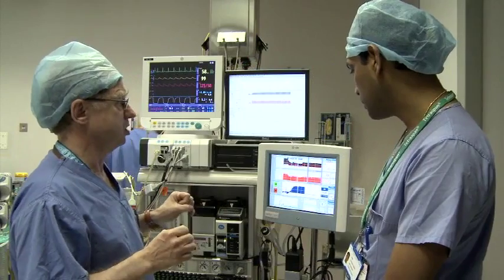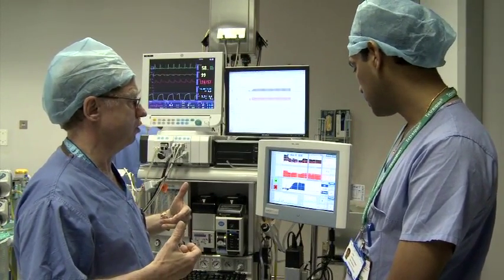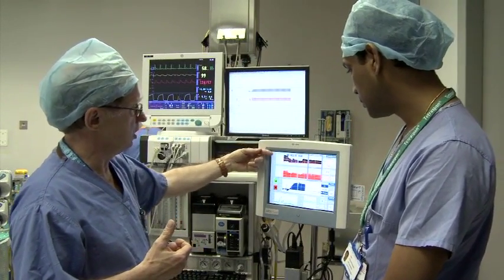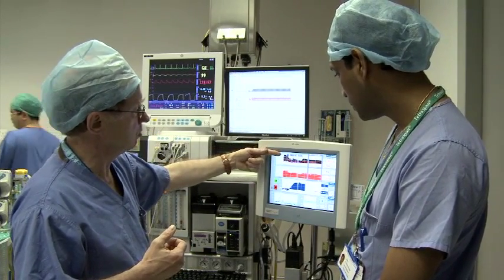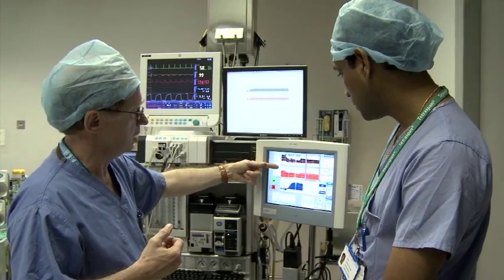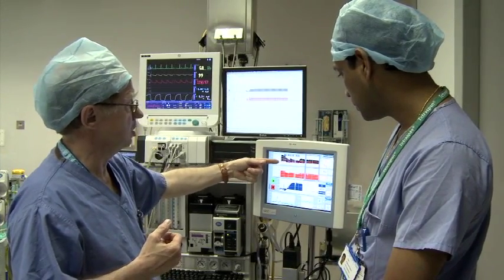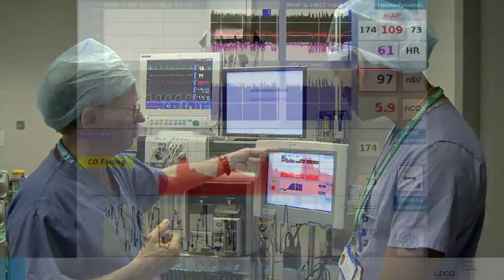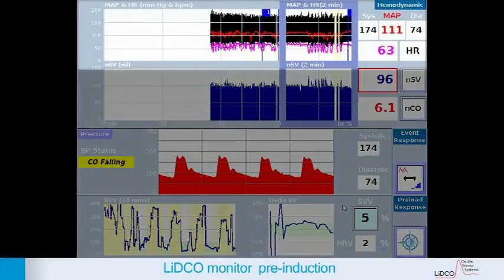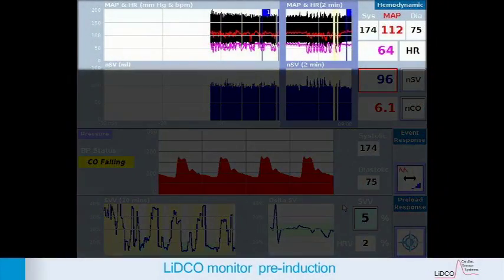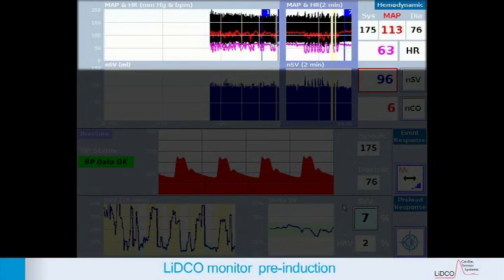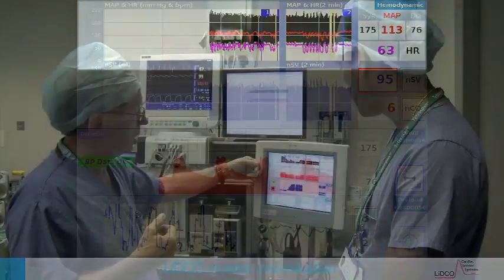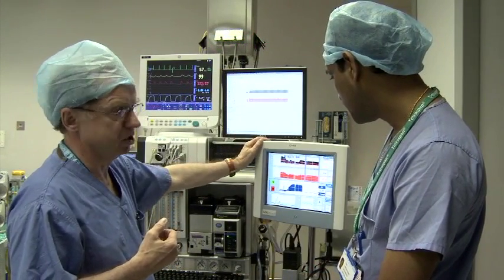What we're achieving with the LIDCO basically is to set one parameter — that's his cardiac output and his blood pressure — and displaying it continuously on the screen. On the left-hand side of the screen, we've got his starting blood pressure and his starting cardiac output, which is about 180 over 80. The black portion is blood pressure, the red portion is the mean pressure, and the purple is the heart rate. His cardiac output is running about five litres.